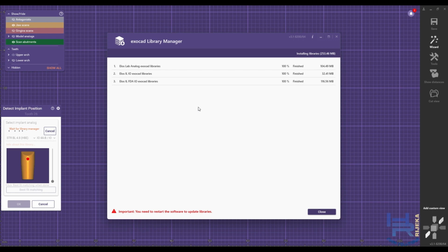Similarly, if you're looking for library systems in 3Shape, 3Shape libraries are basically enabled by 3Shape themselves, and then they become available to activate inside the 3Shape software. So you'll want to reach out to your 3Shape provider and let them know what libraries you need enabled, and they can reach out to 3Shape and have those enabled in your software.